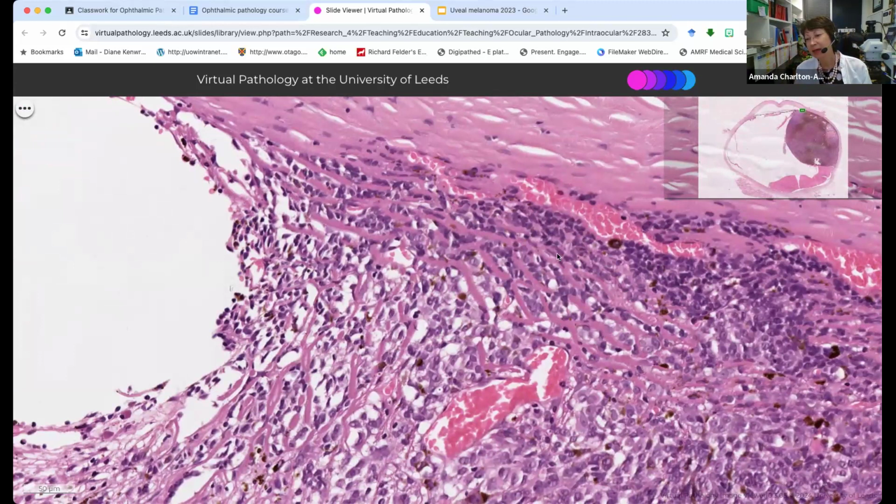And then outer towards the sclera, there are these dark fellows. What could they be? Could they be lymphocytes? That's what I thought they might be as well. So it's a trick, isn't it? They're not all tumour cells. Tumours attract lots of lymphocytes, and you will see us reporting whether there's a brisk or a non-brisk lymphocytic infiltrate in these melanomas.